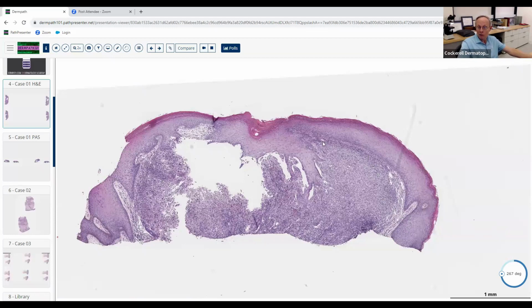There's some dark cells at the periphery here. But what about these cells? Yeah, there's some lighter ones mixed in. Good. And it seems to me like these lighter ones predominate more than these darker ones at the periphery. So that's kind of a clue. If it's an inflammatory process, meaning it's comprised of inflammatory cells, and the cells at low power look pale to you, what kind of cells do you think they most likely are going to be?